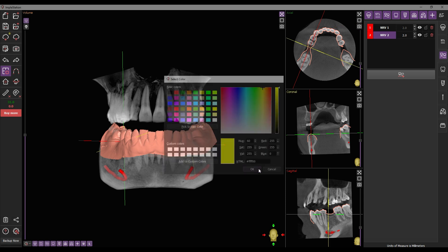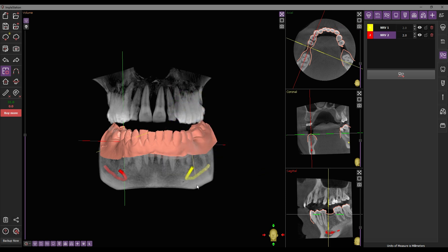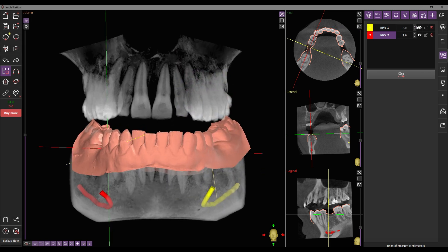In the work panel list, change the canal's color by clicking on the color indicator. Toggle the visualization, change the nerve diameter, or lock or delete it as needed.